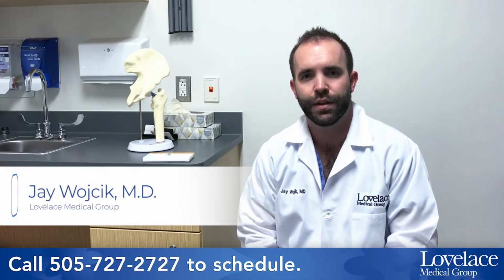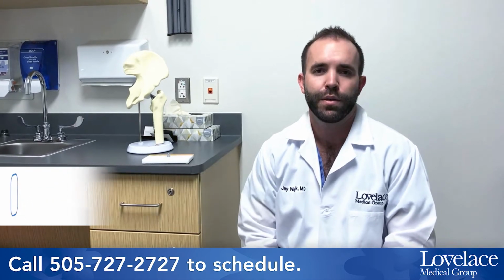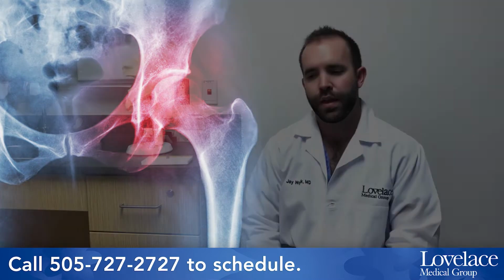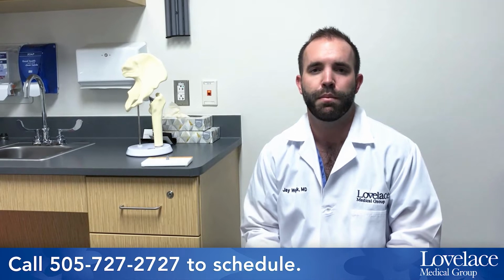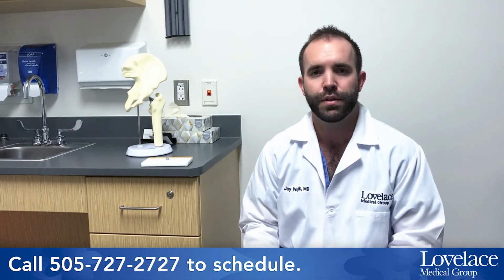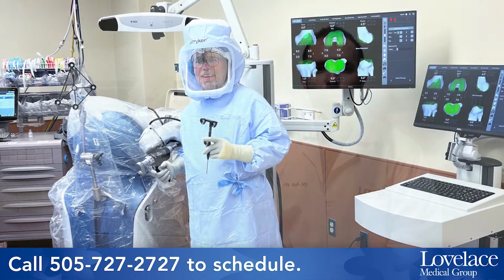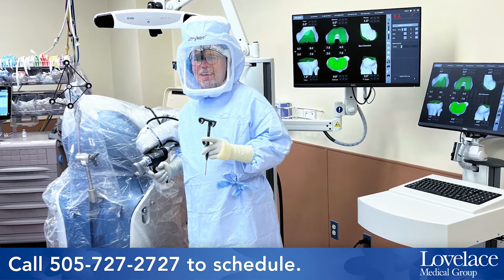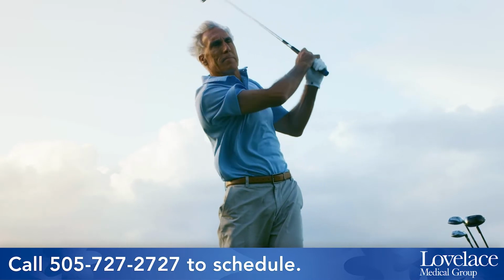Robotic-assisted surgery allows us to do a few things. It starts with the preoperative planning. We start by getting a CT scan of the patient's joint, and that better helps us make a plan three-dimensionally. And then in the OR, the robot allows us to incorporate some more unique features about the patient's anatomy to help precisely position those components. And then finally, through a haptic arm, the robot helps us prepare the bone down to the 0.5 millimeter in a very precise fashion. And it's with this increased precision that we hope we achieve better early and late outcomes.